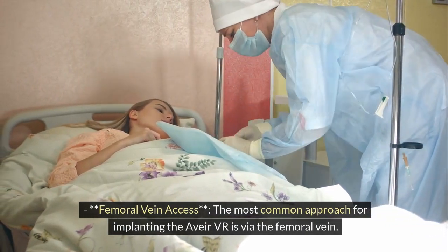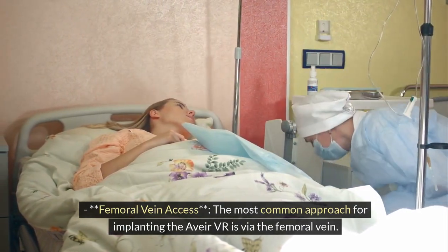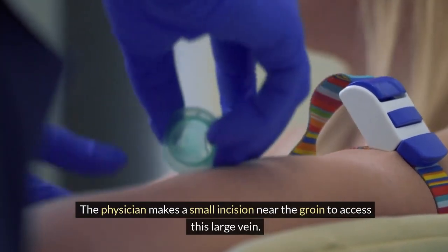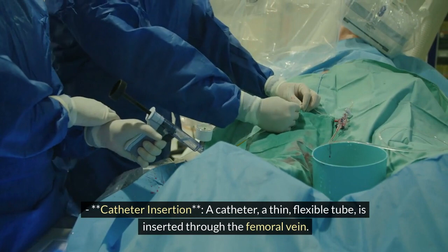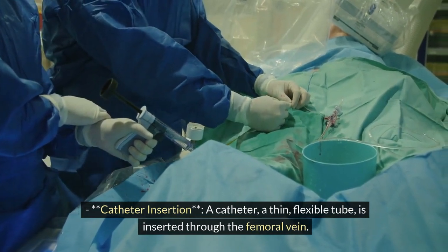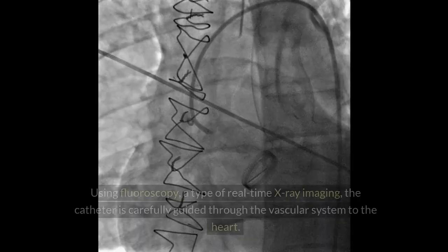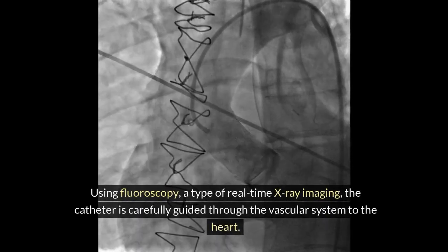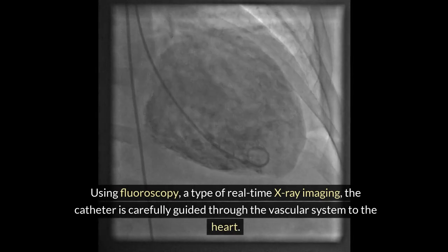The physician makes a small incision near the groin to access this large vein. Catheter insertion: a catheter, a thin flexible tube, is inserted through the femoral vein. Using fluoroscopy, a type of real-time x-ray imaging, the catheter is carefully guided through the vascular system to the heart.